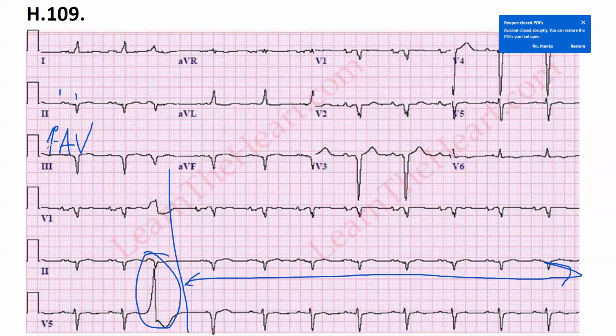So this patient does have a first degree AV block and had only one PVC here. That's okay, it still can be normal, but this longer PR cannot be. So this is why this patient has a first degree AV block. Okay, go on. So now you can go to pathological Q, QRS.